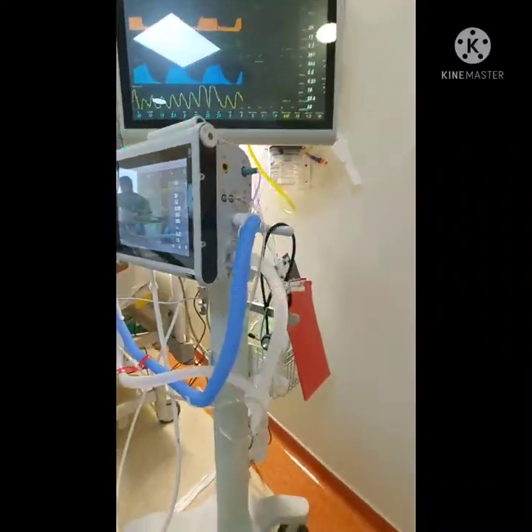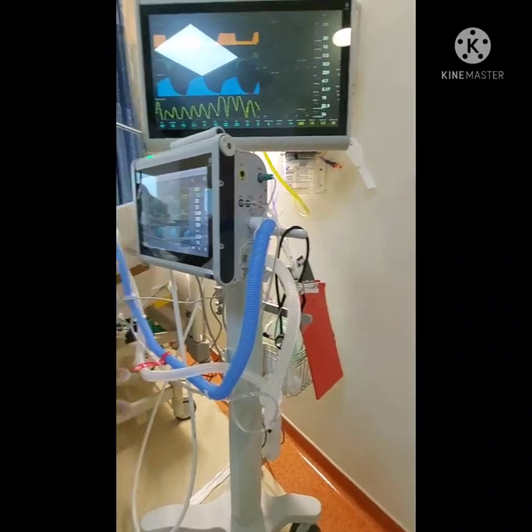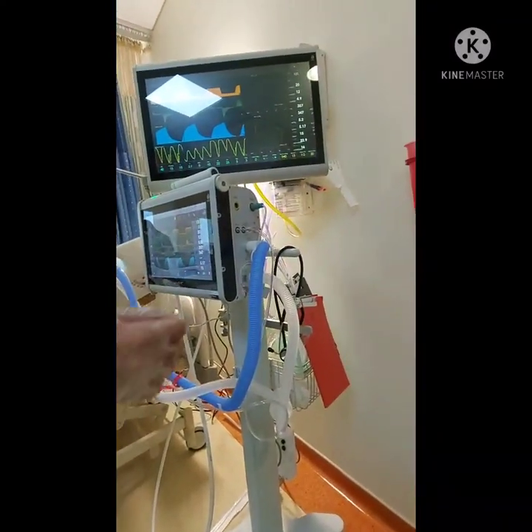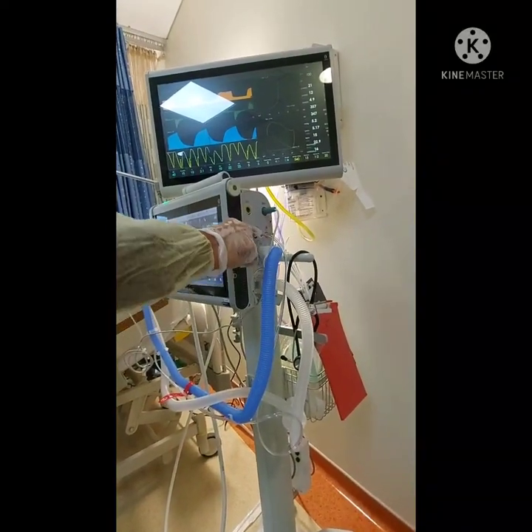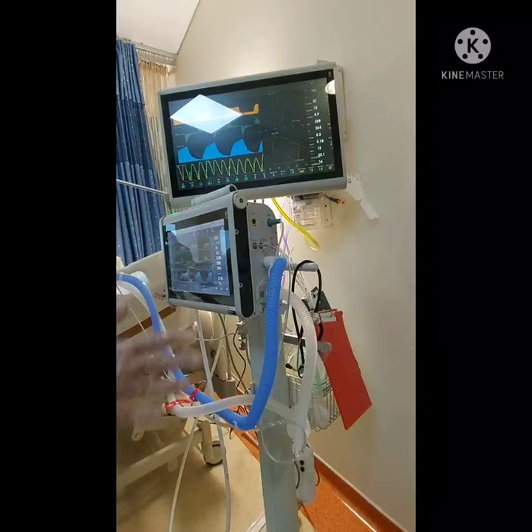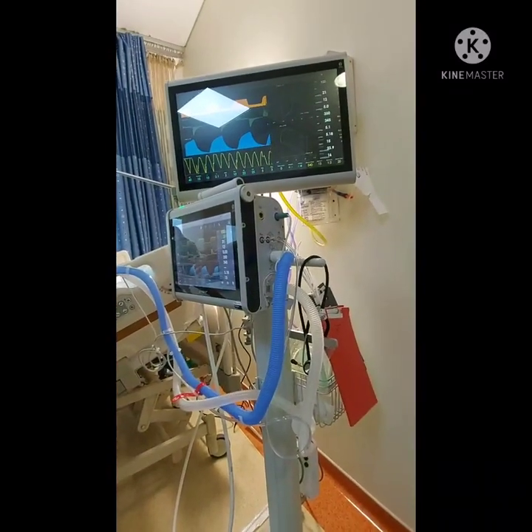Okay. So, there's tubes there? Yeah, some of the breathing circuit. You will get the tubes with the breathing circuit. These tubes you can connect over here, and you can connect over here. So the machine will monitor your auxiliary pressure, exactly the pressure the patient is getting.